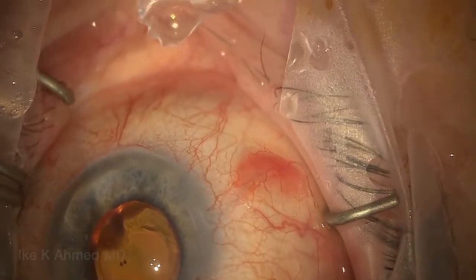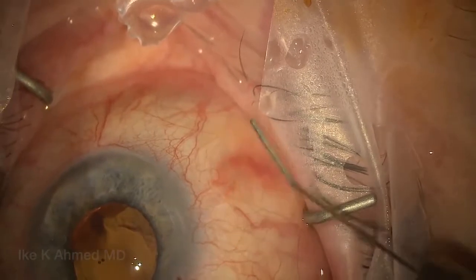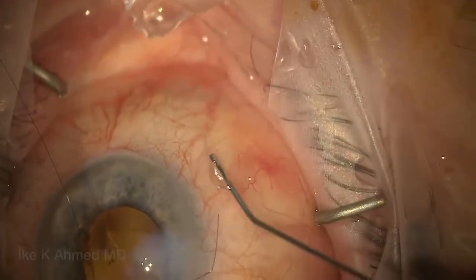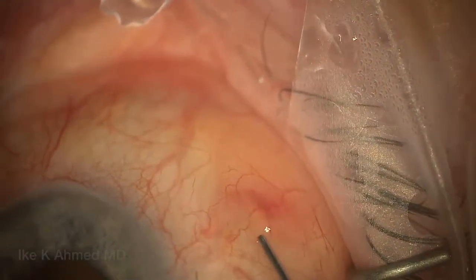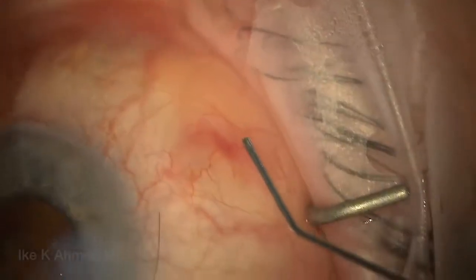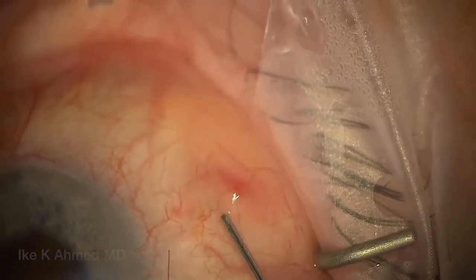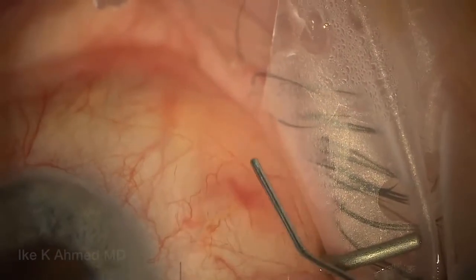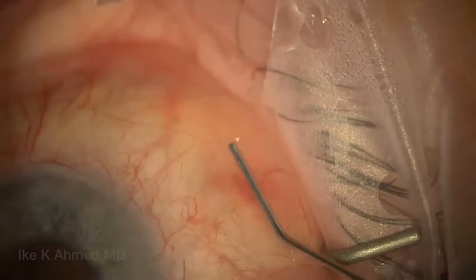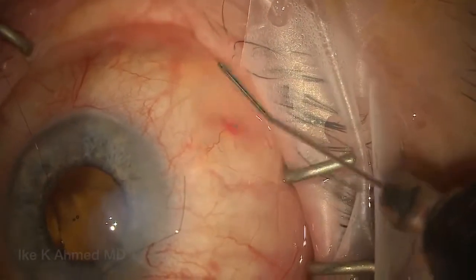We'll now inject BSS in the anterior chamber, removing the Helon GV while we do that. Watch the bleb form — this is priming the implant. You'll see very quickly how wide the bleb forms, which tells us we're quite superficial. The fluid is all going more sub-conjunctival, and the implant is actually sitting up, rising away from the sclera — this is an ideal position, telling us that the placement is superficial. It's not deep because the implant is sitting above tenons and actually under conjunctiva, rising above the sclera. You can see how wide the extension of that fluid goes, confirming more sub-conj rather than sub-tenons or intertenons placement.